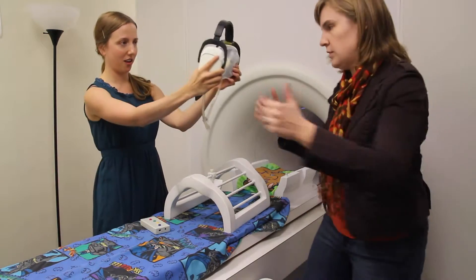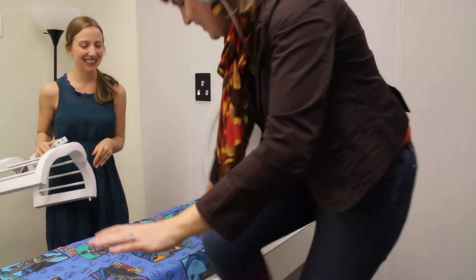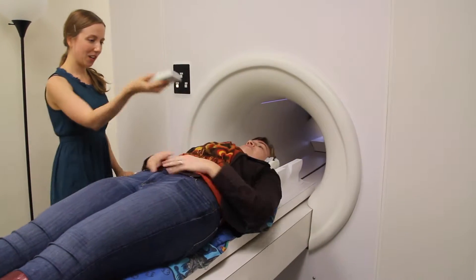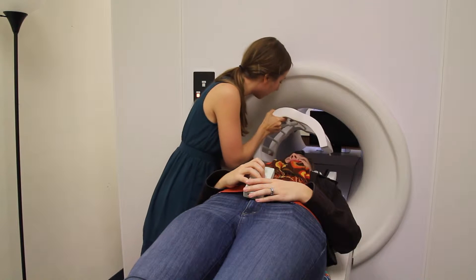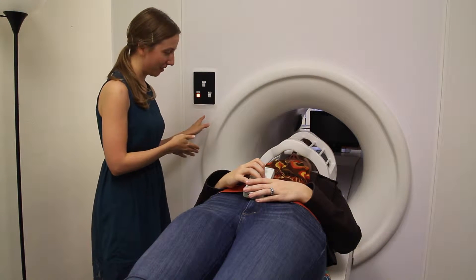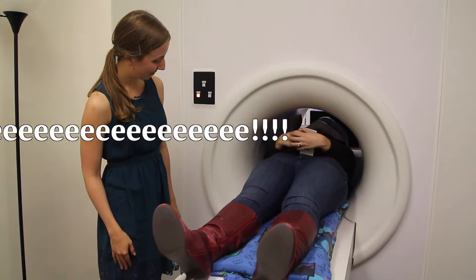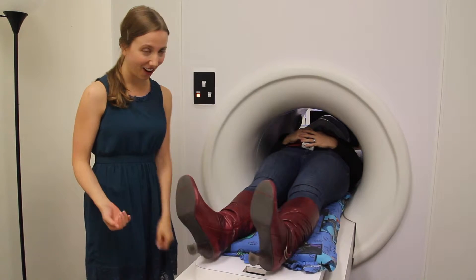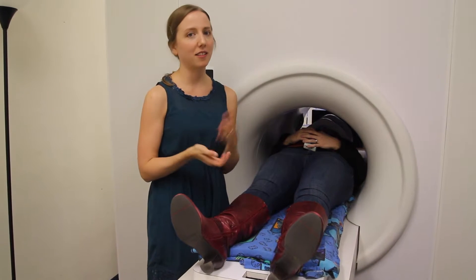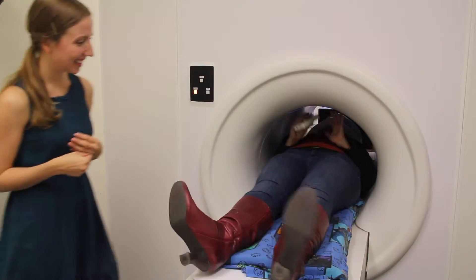Let's get Sarah ready to get in. She needs to put on her headphones, then we're going to have her climb up on the bed, lay down, head goes here, nose goes up. I'm going to give you your video game controller — you can hold it on your stomach. I'm going to put this mask down over the top of your head, click in these pins, and here's your mirror — you can adjust it once you're farther in so that you can see. Once I press the button, you're going to slide back into the tube — it's like a really, really slow roller coaster. So there she goes, and Sarah is pretty tall, so almost her entire legs are outside of the MRI scanner. If Sarah was a real child participant, we would have her practice watching some of the DVDs and playing some of the computer games to make sure she's completely comfortable and knows what to expect when she comes back for her real MRI scan.